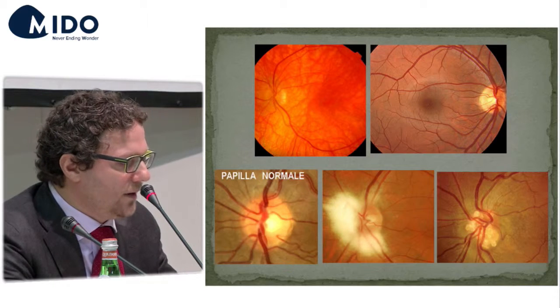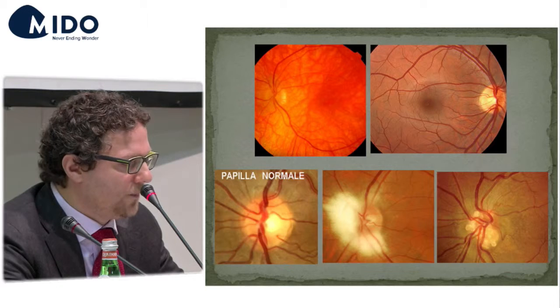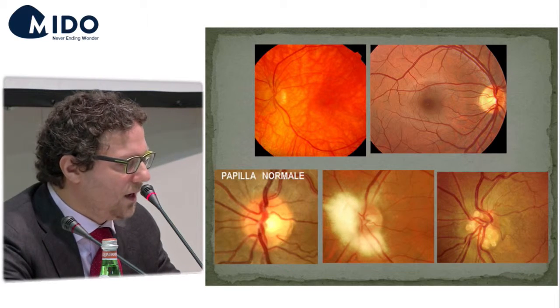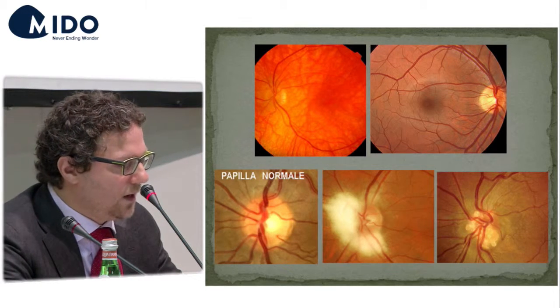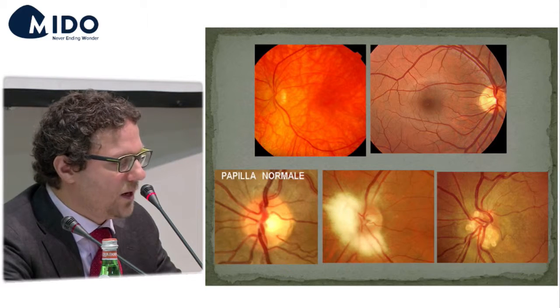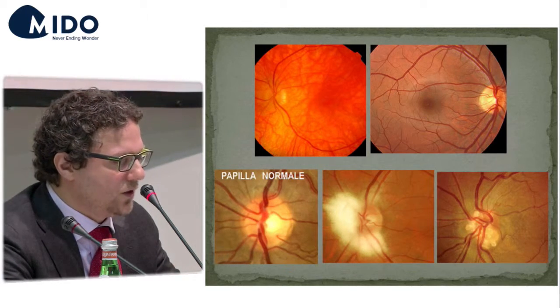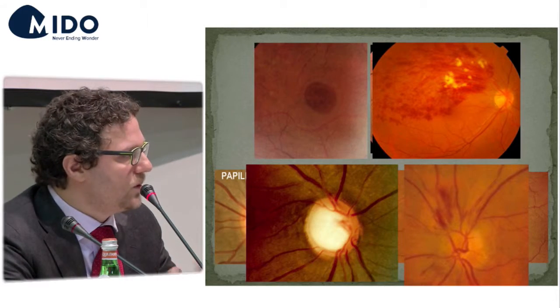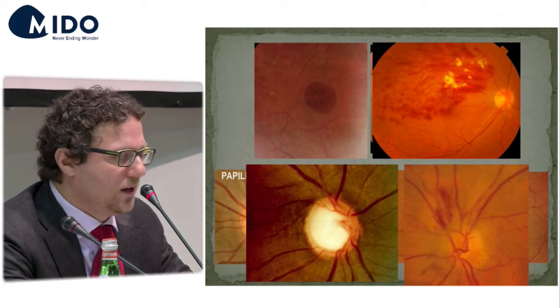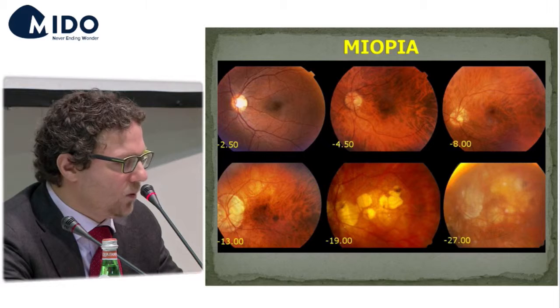This is normal retina. In the top part, you have the normal retina of a young person without retina-related problems, and in the central part, you have myelinic fibers and drusen of the optical nerve. In case you identify complex situations, you can refer the patient to the most adequate venues.